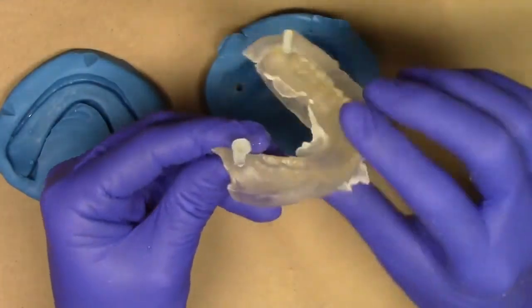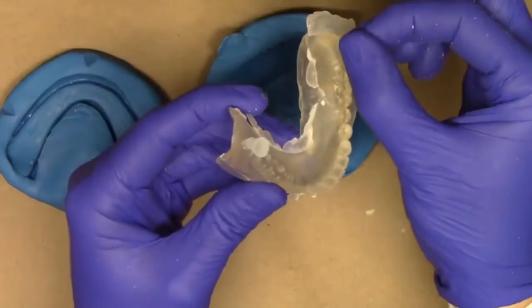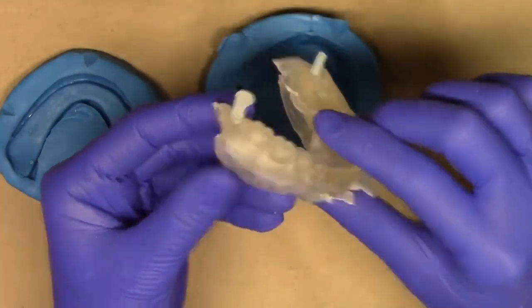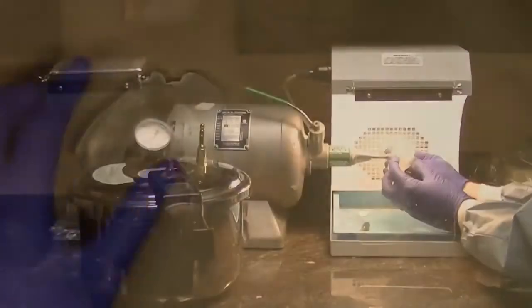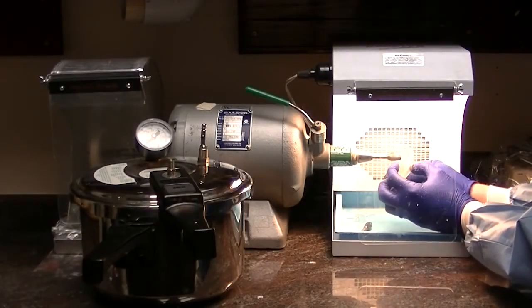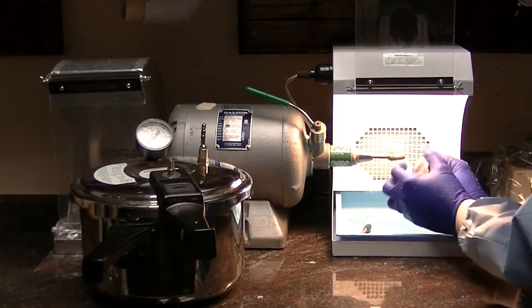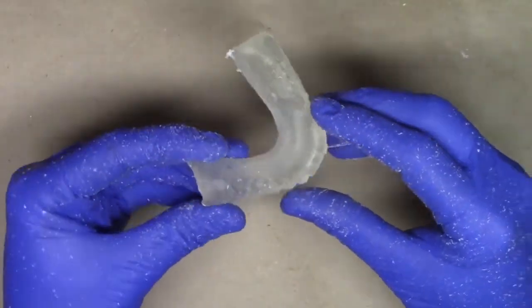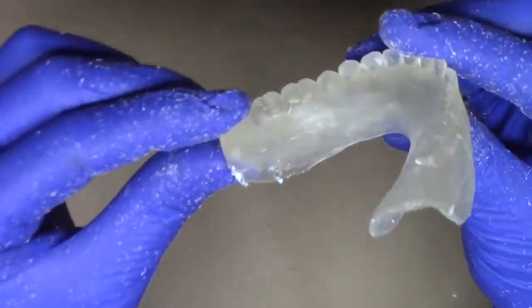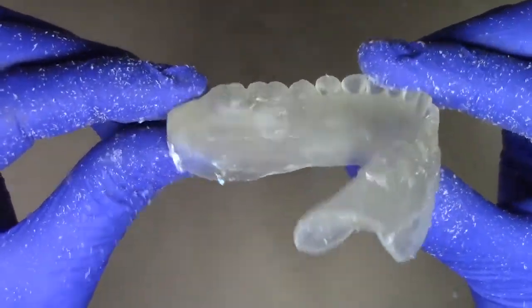If I don't use these injection channels, a lot of times this material will either be overfilled or you could have some suck back and there's going to be voids inside of here. At this point, I can put my putty aside while I take some burrs just to start to smooth this off. Now, as you start the finishing and polishing procedures, you might occasionally notice a little void on the inside part of the surgical guide.